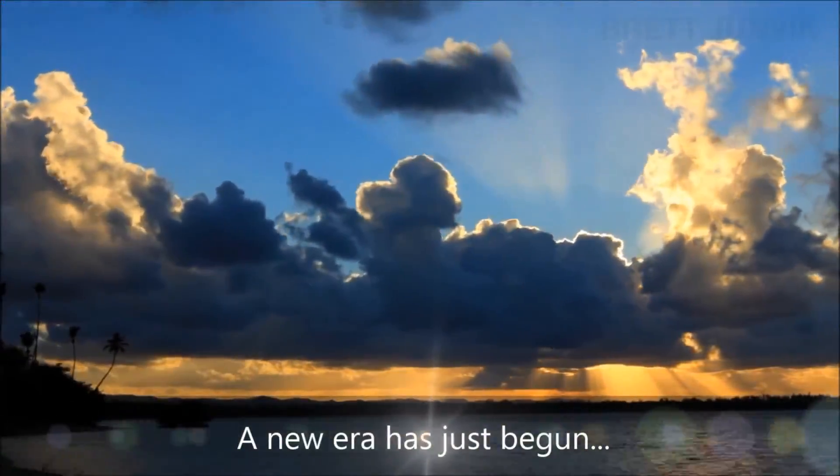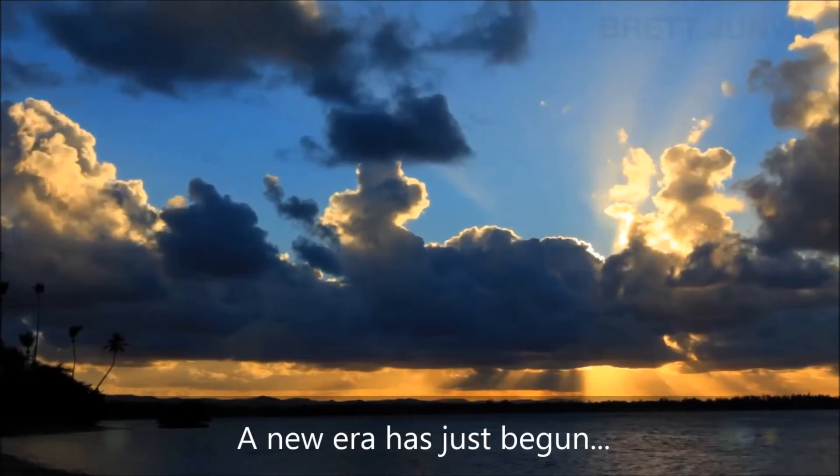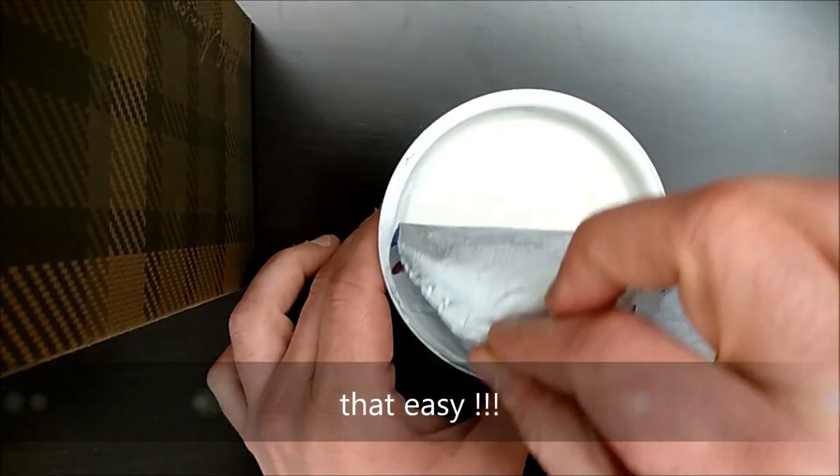A new era has just begun, and it's upon us to decide how we move further, as DMEK graft preparation can now be that easy.